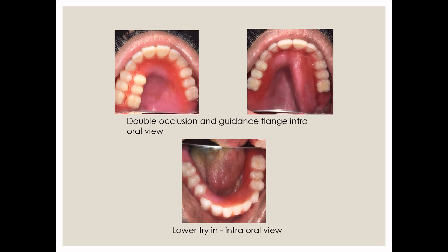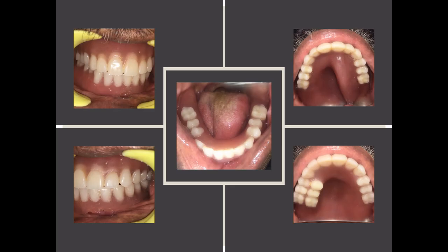So here when comparing these two approaches, the double occlusion or the twin occlusion technique was found to be more effective than the other. So here the broad occlusal table developed in the maxillary arch on the non-defect side helped to position the residual fragment into correct sagittal relationship, enhancing the stability of denture and thus improving the masticatory ability. So this reduced the accumulation of food on the non-defect side. So this was the final look at the insertion stage.